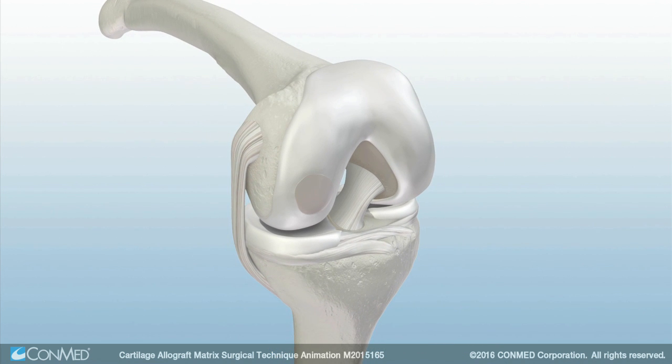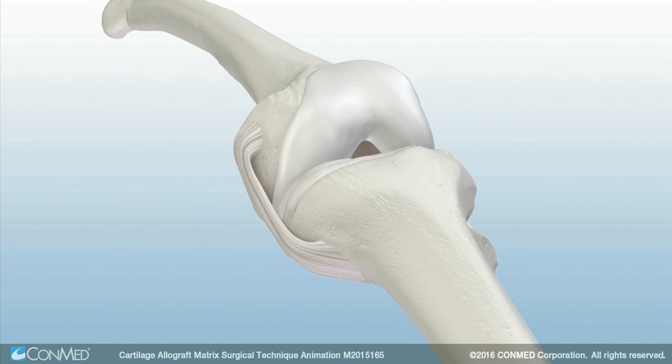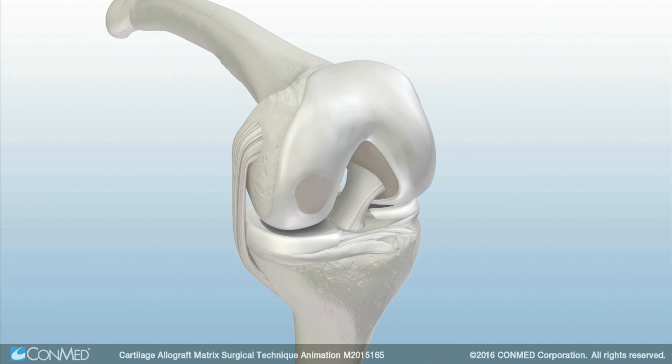Let sit for five minutes or until fully cured. At this point, the knee can be gently ranged to ensure adequate adherence of the cartilage allograft matrix into the defect.